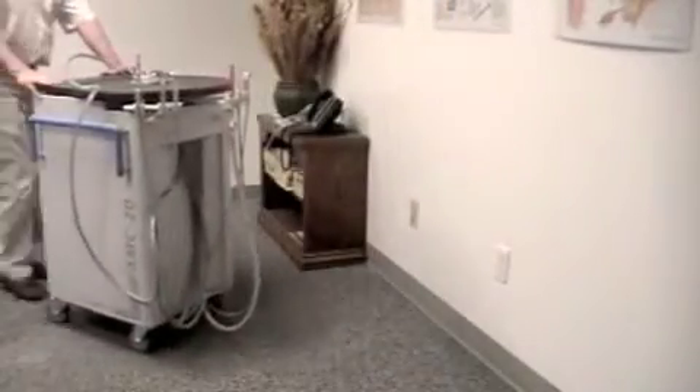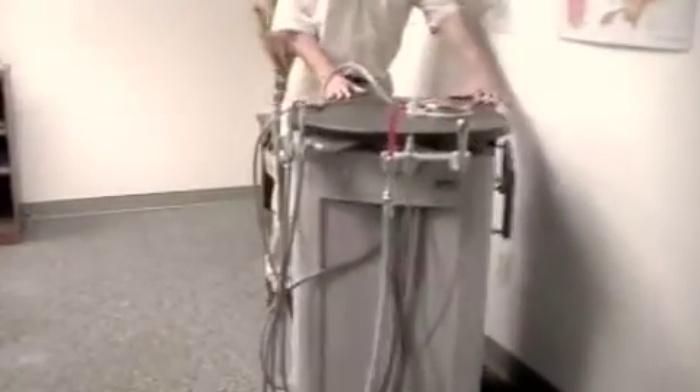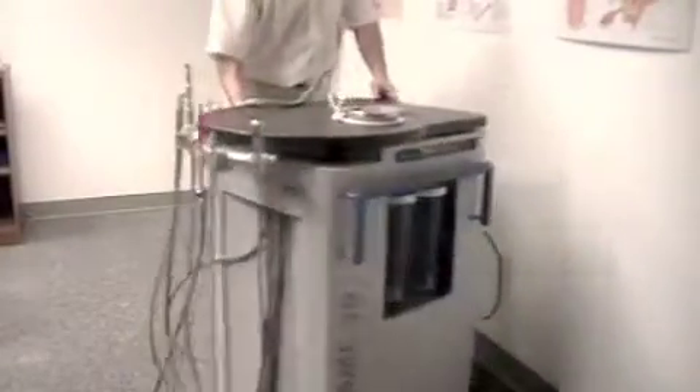Setup is quick and easy. Simply roll the cart to the desired location and plug it into a standard wall outlet. The AMC20 has locking casters to keep it securely in place.